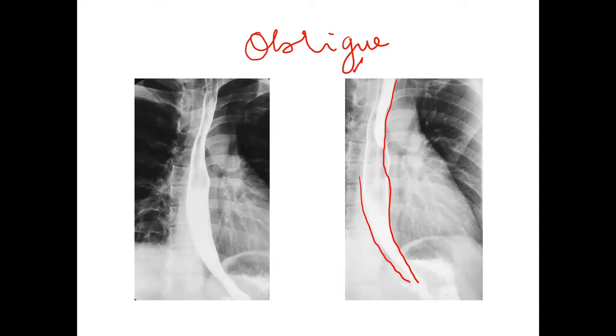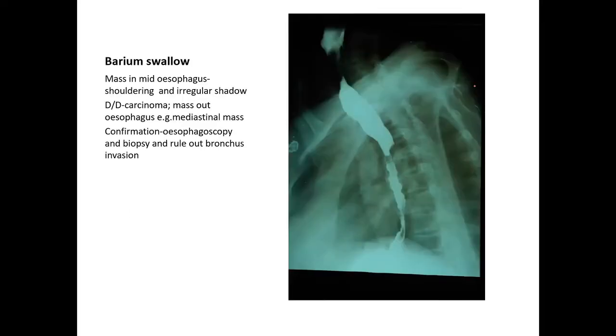And also, you know, in achalasia, there's going to be dilatation here, as well as a bird-beak appearance with absence of fundal gas. There will be absence of fundal gas. So this is barium swallow. You have AP, lateral and an oblique view.